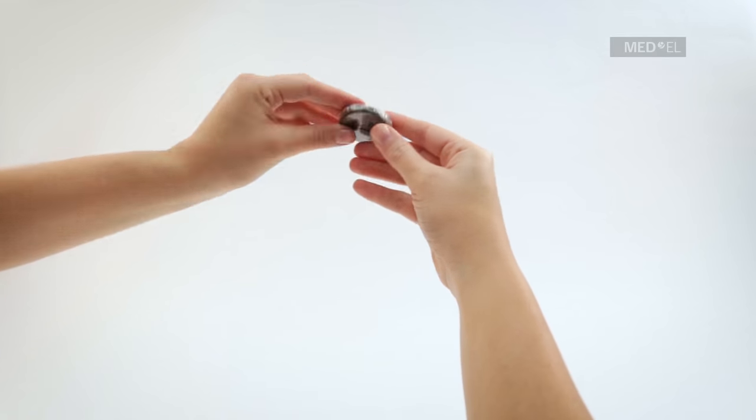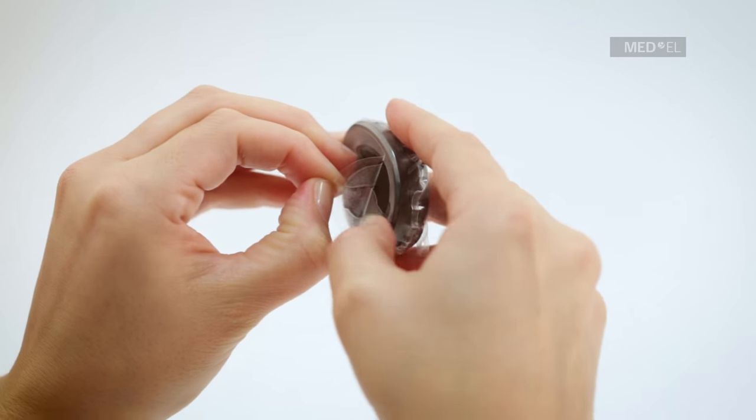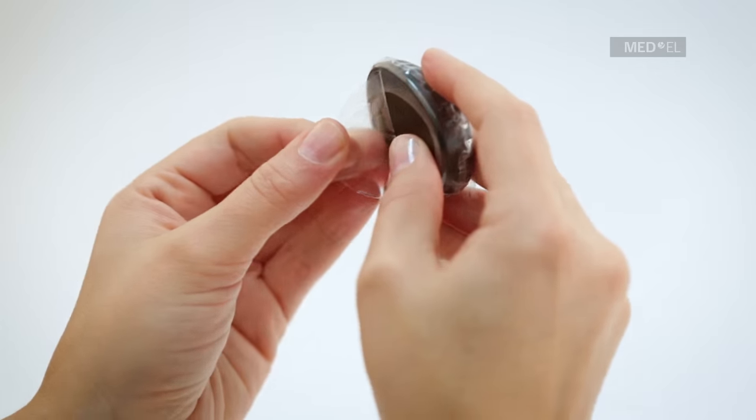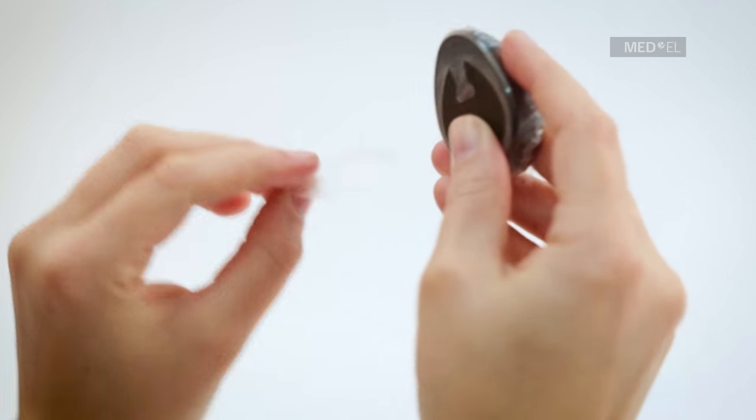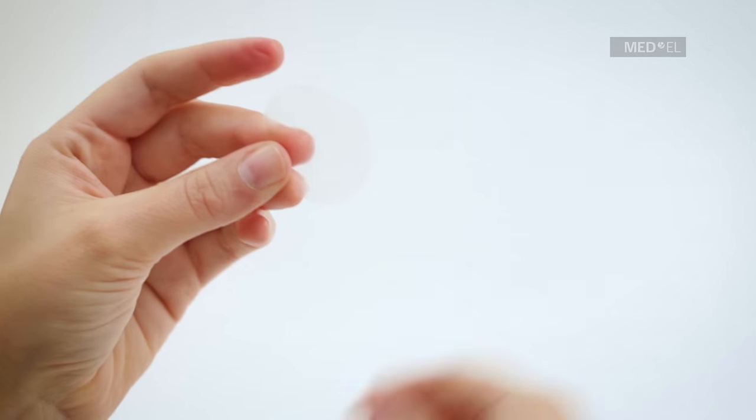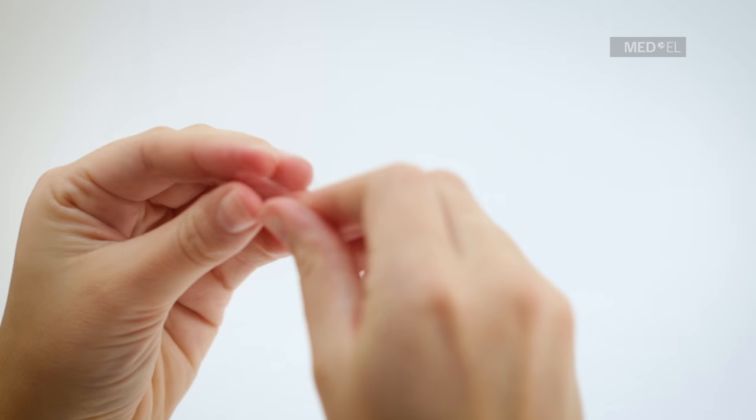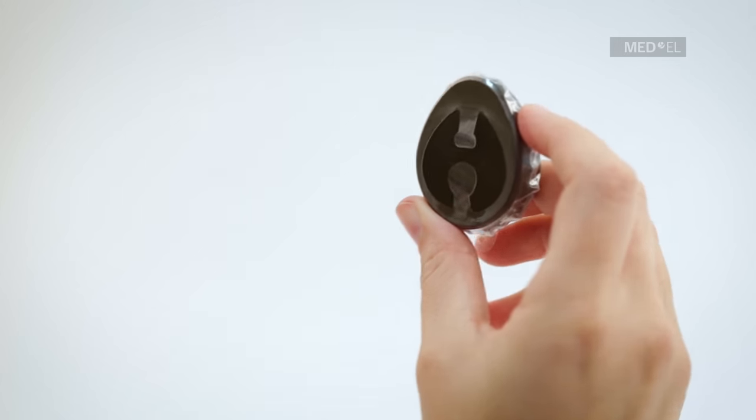To remove waterware from Rondo, carefully remove and discard the adhesive strip from the waterware. Use the circular flap of the waterware to remove Rondo from the waterware.